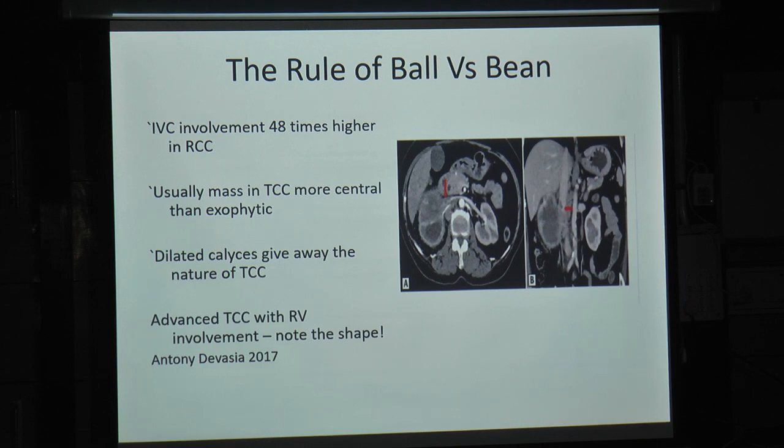Oh, last line. Advanced TCC with renal vein involvement. Note the shape of the kidney.